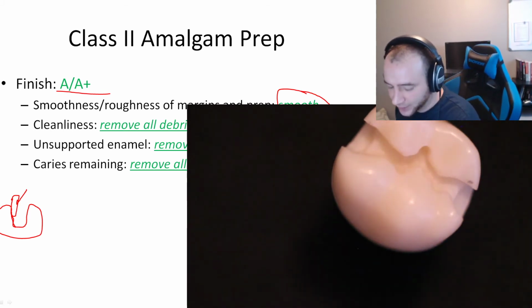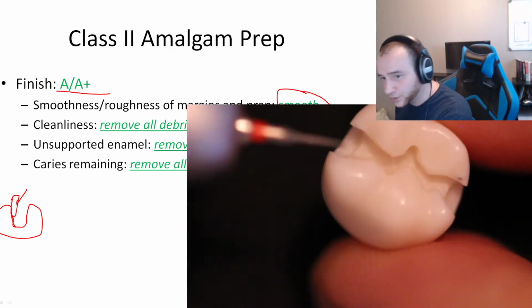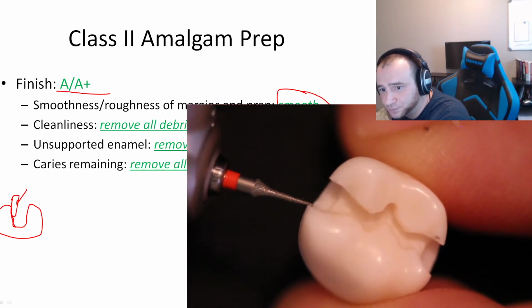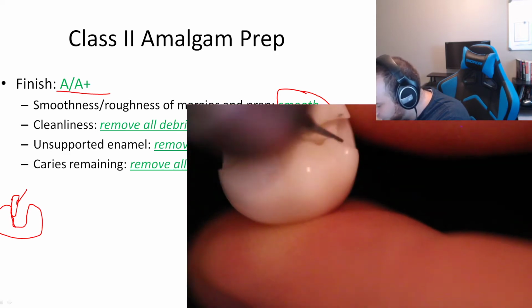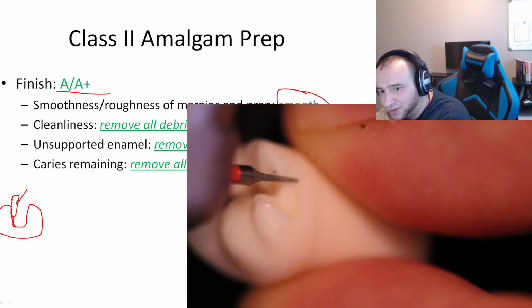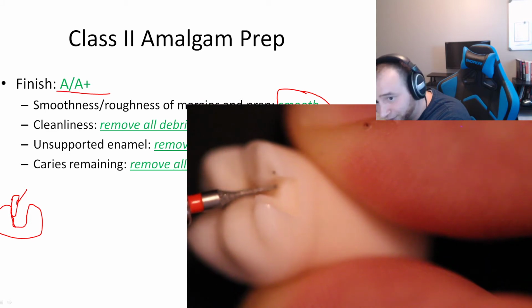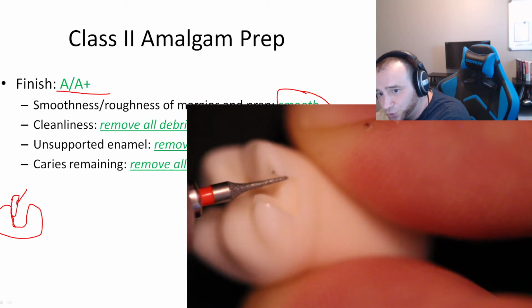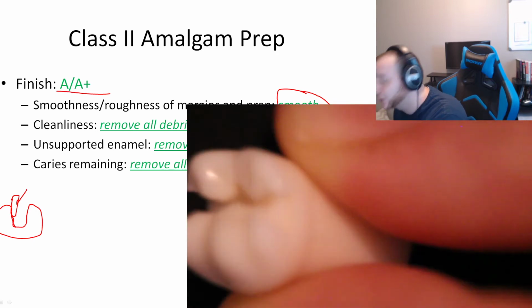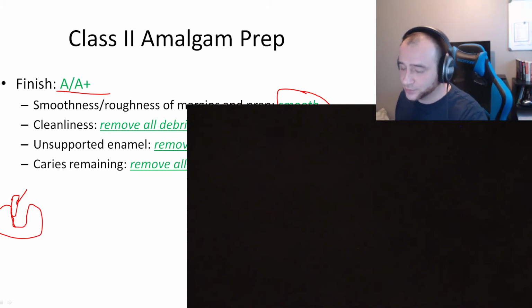Now, some people, again, like to use the needle burr, or this burr, whatever you want to call it here, right? I don't like it because it causes roughness on this angle. If you want to do the same thing, where you go all the way deep to the wall like this, it's too pointy. It'll just cause this weird groove for me. And if you try to do it like this, where you angle and just hit the unsupported enamel with it, you're going to create a groove. I've almost always created a groove here in that proximal cavosurface margin, and then I had to repair the groove, and I ended up with a bigger clearance, like a 1 millimeter clearance, but with no unsupported enamel. That's fine. That's a good strategy.